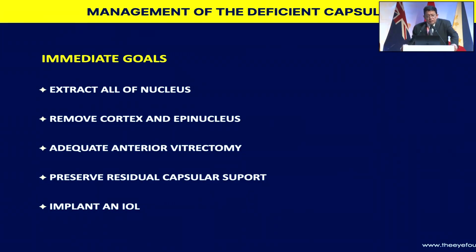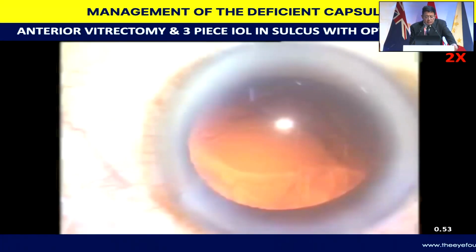It's most important that you do not damage the eye irretrievably. And just in case a significant amount of nucleus or lens matter has dropped into the vitreous cavity, it's better to enlist the support of a posterior segment colleague. So let's look at this bunch of videos.